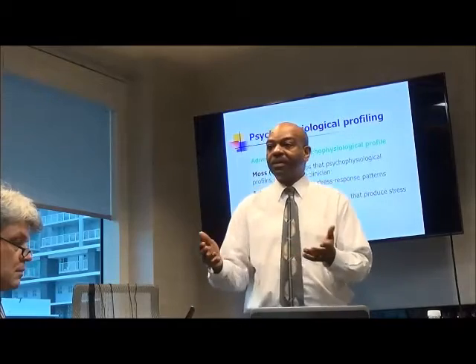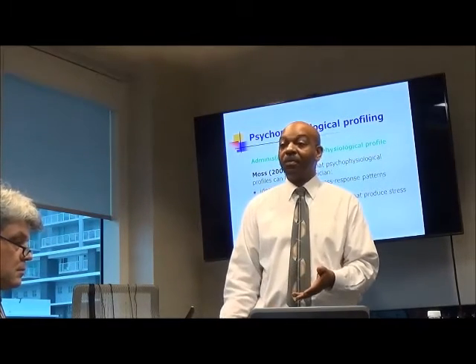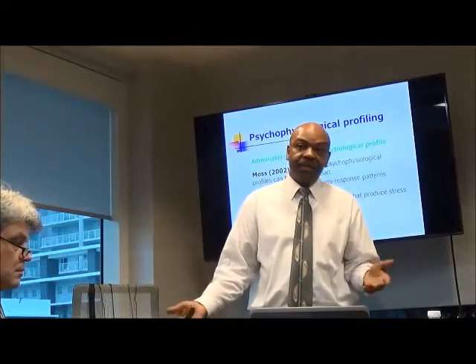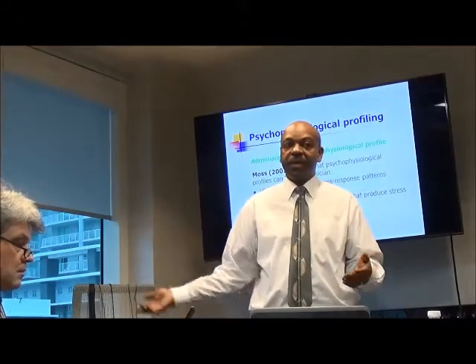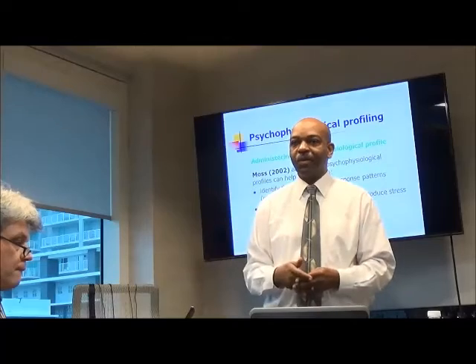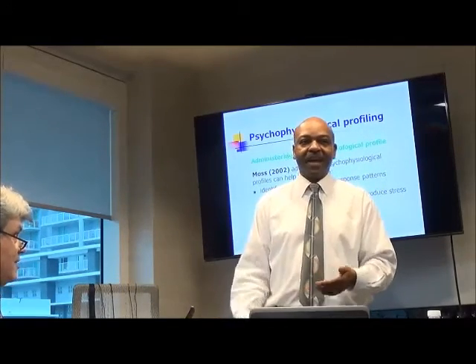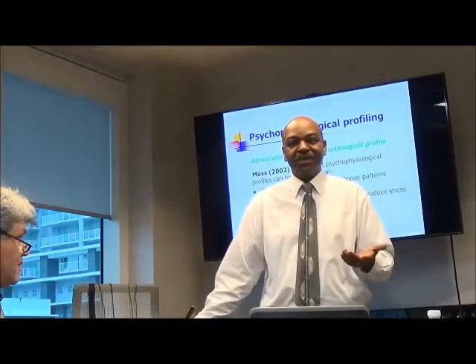So I think I saw him after that 4 sessions. And within that time, his muscle tension got down to 4 microvolts. And his pain was gone. So when he came back, he was coming in the clinic to do other things. And I said, come in for your biofeedback session. He said, I don't need it anymore. I said, well, we're supposed to do 4 sessions. And he said, well, the pain is gone, so I don't need it anymore.